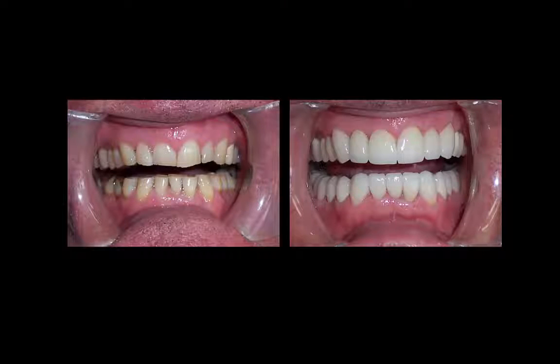So what did we do for this gentleman? We performed a full mouth reconstruction where we seated 28 crowns and veneers on his teeth to accomplish his goals. Obviously the cosmetics are much better and we also established the occlusion. We made his teeth a little bit longer, similar to the shape they were in when he was a child. He brought in photos of what he looked like as a child and also gave us photos of people in magazines that he liked.